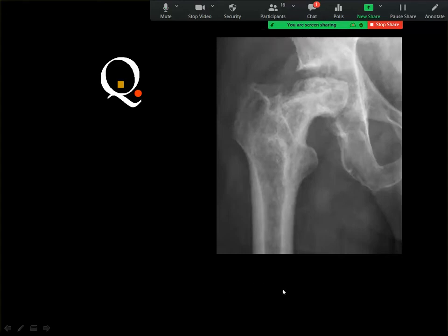No? Other possibilities? Perthes disease. No? There are three participants who would like to answer.